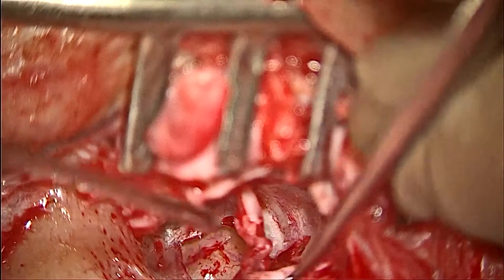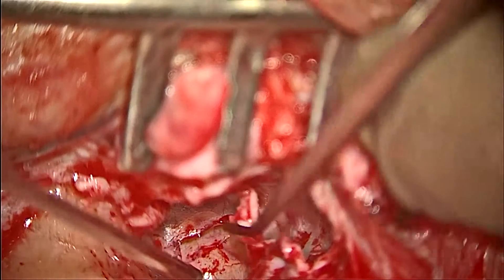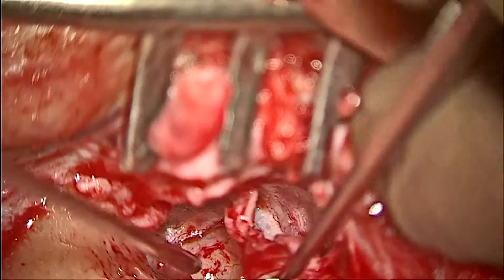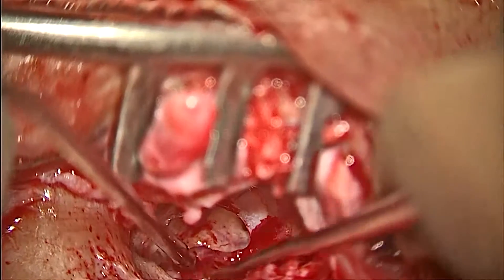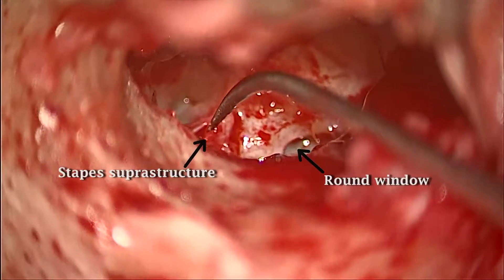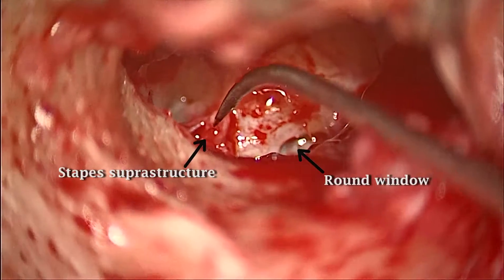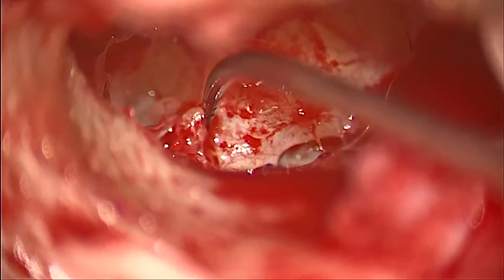The tympanomeatal flap was elevated and the perforation is seen here. The stapes was exposed, the suprastructure was intact, and the round window reflex was checked.